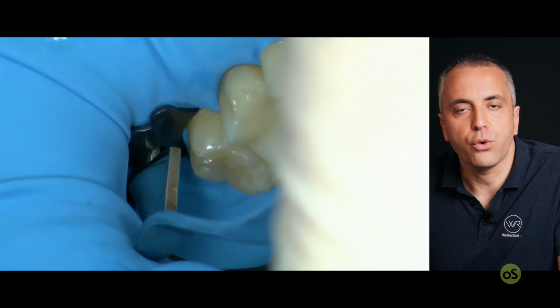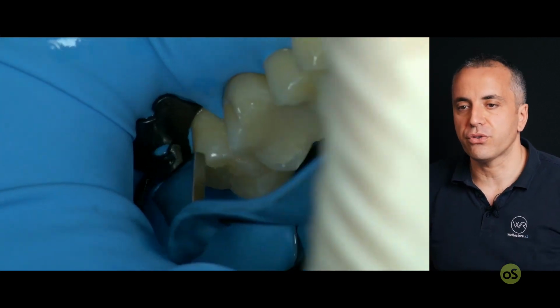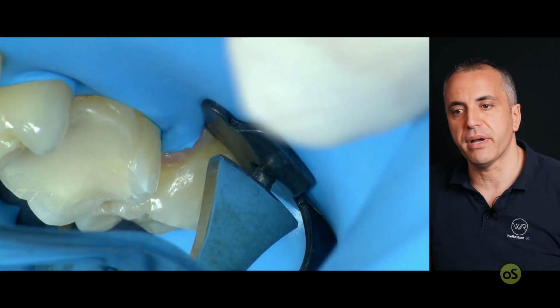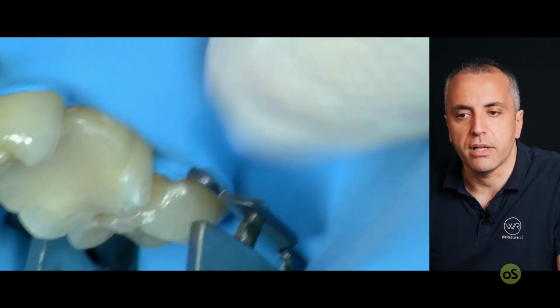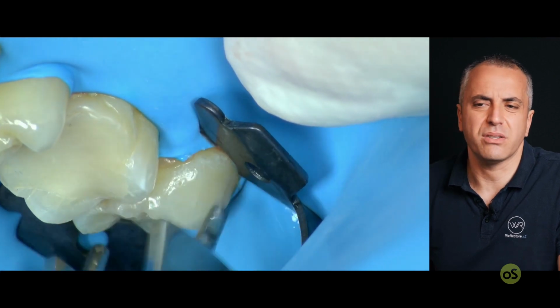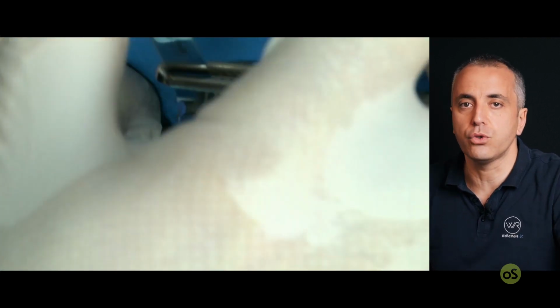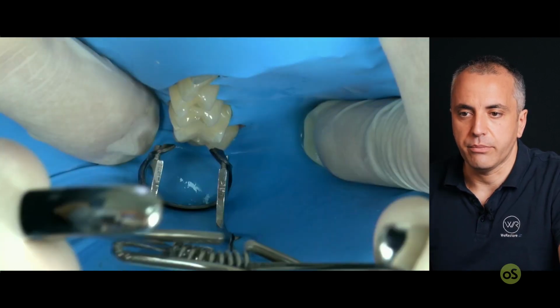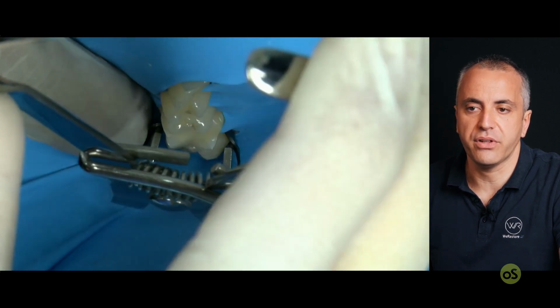In several cases you can move the clamp in order to obtain a better adaptation. You see, palatally, sorry, I don't like it at all. The clamp is not nice, it's going on the rubber dam. So I decided to change the clamp and choose a different shape.